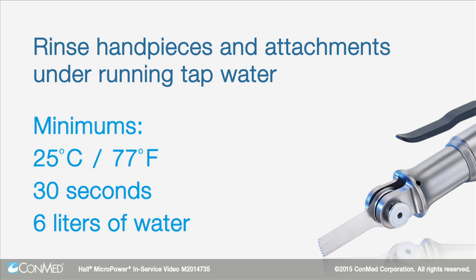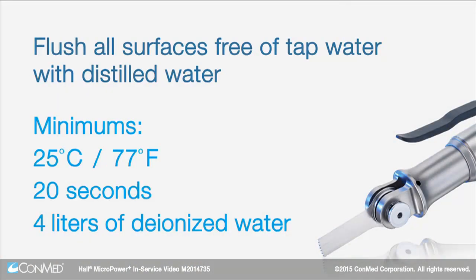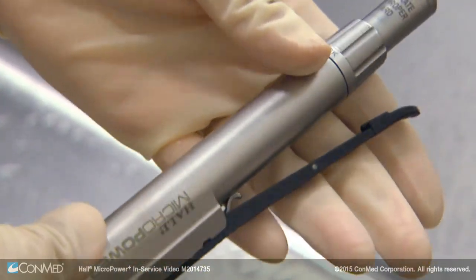Rinse the handpieces for a minimum of 30 seconds using a minimum of 6 liters of water. Flush all surfaces free of tap water with distilled water at a minimum temperature of 25 degrees Celsius or 77 degrees Fahrenheit for a minimum of 20 seconds using a minimum of 4 liters of deionized water. Ensure that the handpiece is visibly free of detergent or cleaning residue.